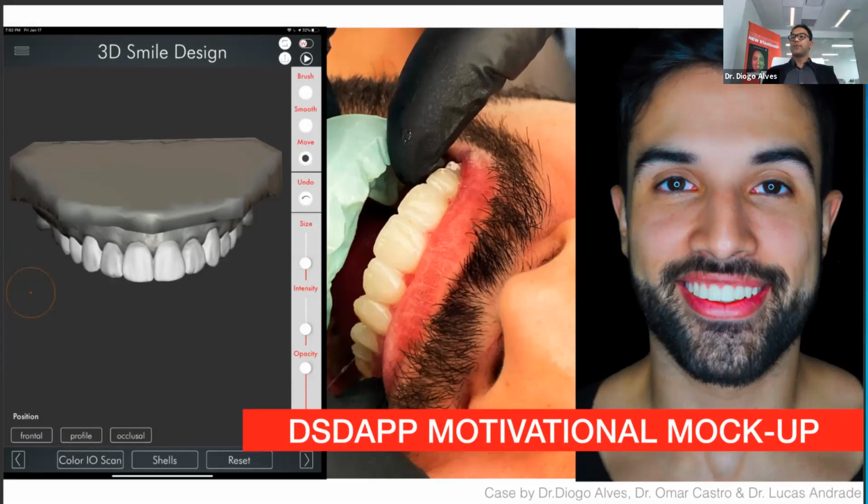That's correct, and that's something that we also call the motivational mock-up. In our online course, we will teach you guys how you can emotionally connect the patient with the project, how you can create those emotional videos. I'm sure you guys have seen it on YouTube. Doctors from all over the world are doing that now, using the DSD app as a tool, which is great.